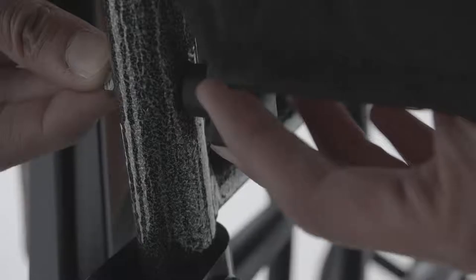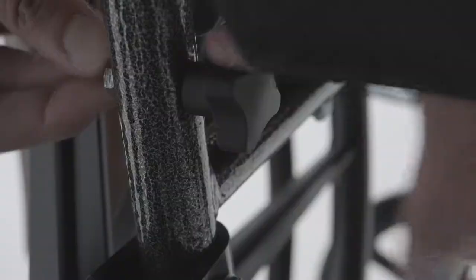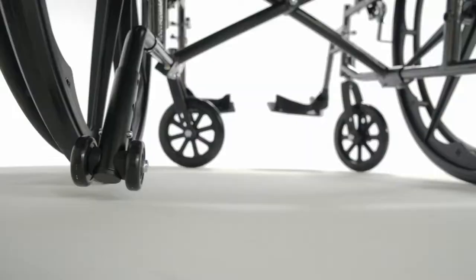On some models, the height of the back can be adjusted in three different increments, which is easily set by securing the rear knobs.